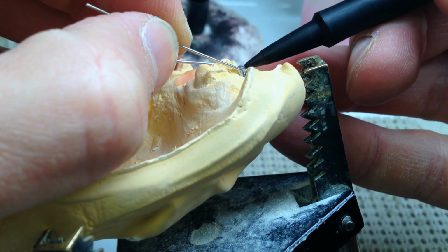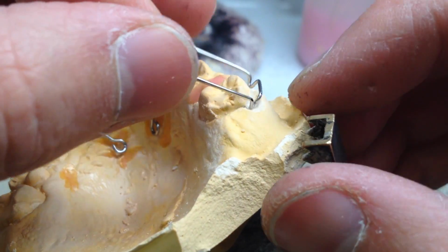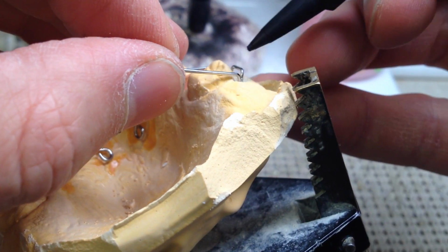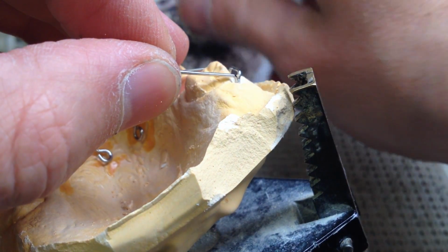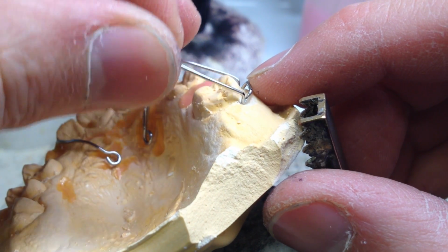So the key bend for this is right here. Hope you can see that. Hold off some of the stuff so you can see better. But like I said, your key bend is right here. That changes the angulation of your bridge.